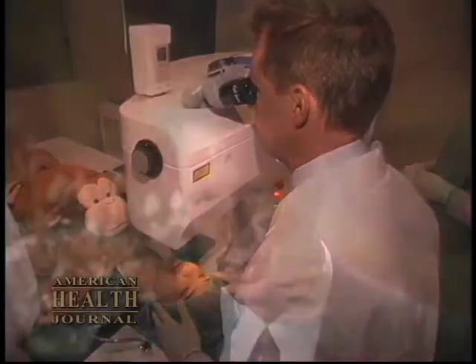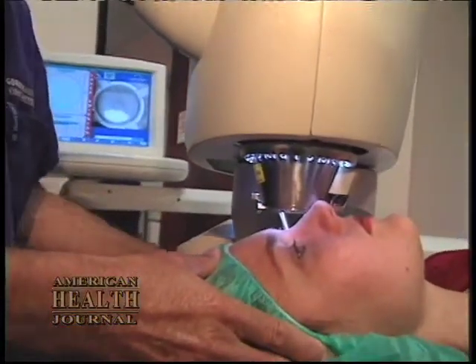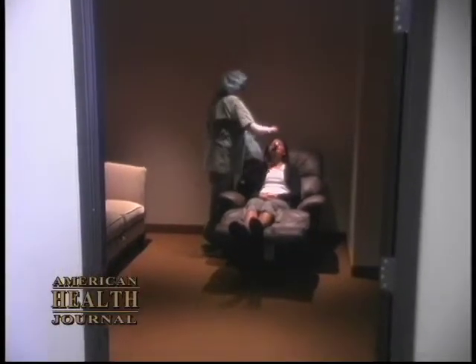Once the laser has reshaped the cornea, we simply put the flap back into place without the use of sutures or glue or any other adhesives. The flap is able to stay in place just by the inherent tissue forces that are present. And once that has occurred, the flap repositioning, we are done. You're able to go back to the recovery room at that point in time. So in essence, it takes about 10 minutes to do a LASIK procedure.